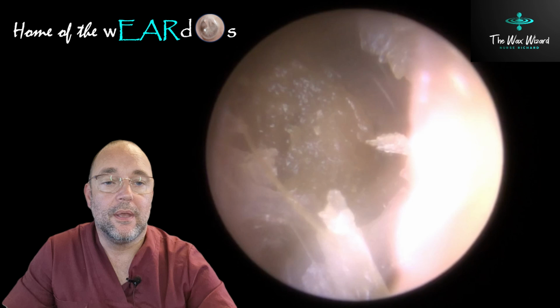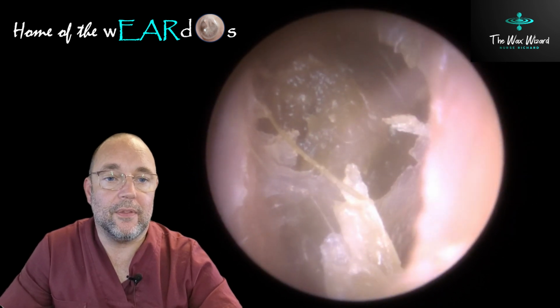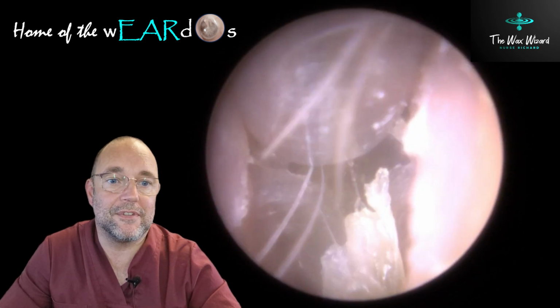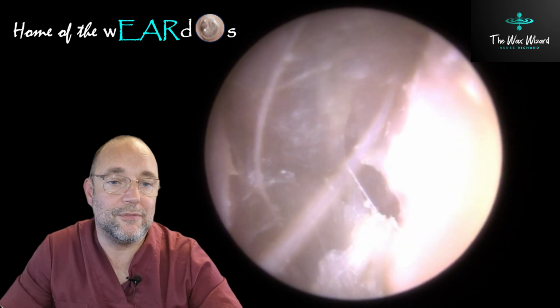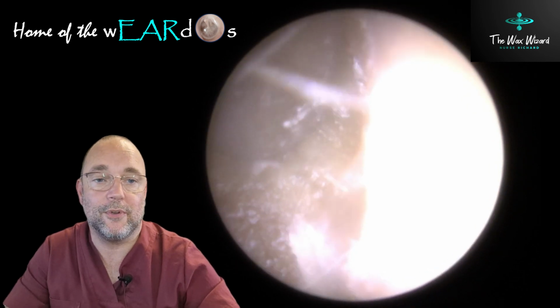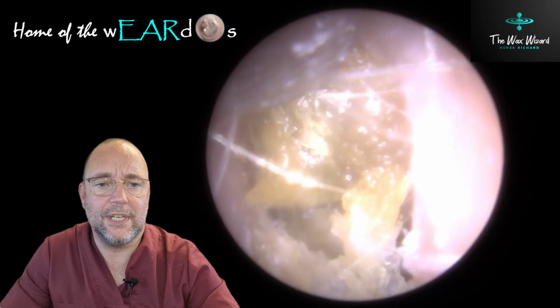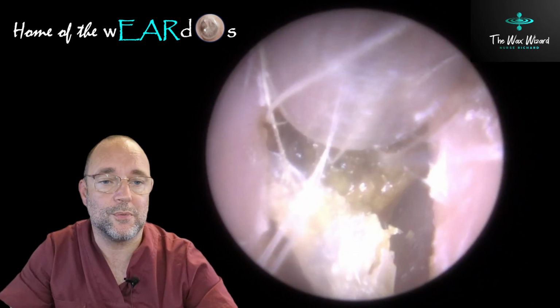Thanks for joining me. Interesting little quick case this. Now this chap, he had one of the narrowest ear entrances I've ever seen. Have a look at this. Now that's the suction tube. It's a full-size suction tube. There was no way the fine end, yes, it would have got in a bit easy, but there's no way it was going to pull something like this out. It was really difficult to get in, and he was also holding his ear and pulling it apart as far as he could as well.